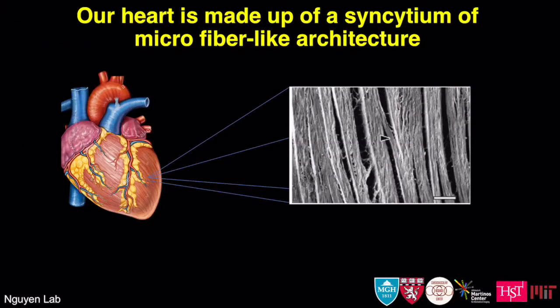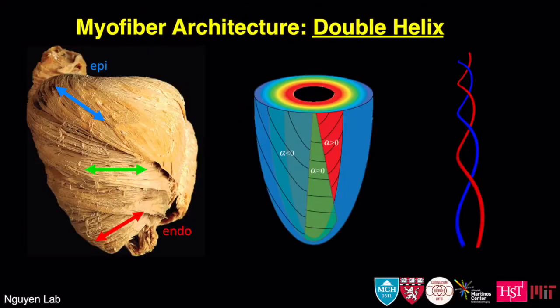So, why do DTI in the heart? I think it's good to remember the structure-function relationships that we have. If we zoom in and look at the actual tissue, at the tissue level, not the cellular level, we realize that the heart is a syncytium. It's conducting tissue, but at the same time, it has this fiber-like architecture. And so if we can characterize that, we can start to understand early on the cracks in the building as they get worse and worse, and maybe have some early predictors of heart failure or heart disease in general.